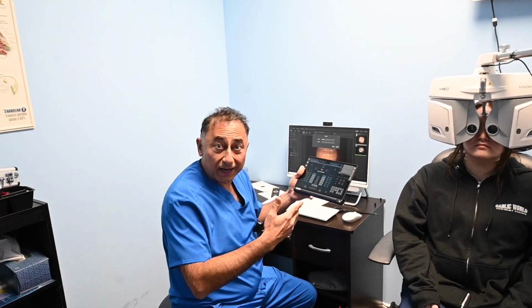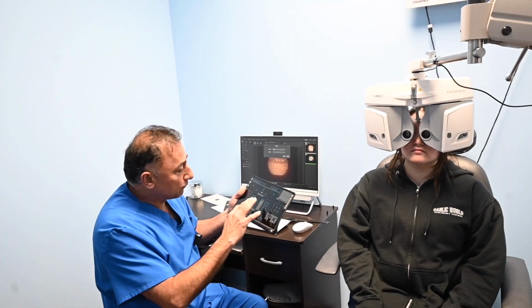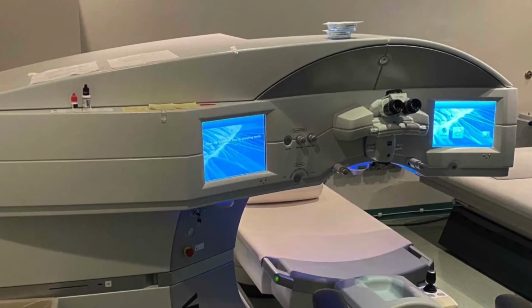Now that you've decided to have Smile eye surgery, and in the consultation you've been proven to be a very good candidate, we bring you to the preoperative exam, where not only the safety measurements which we had done, but we will be doing more advanced measurements and numbers check to make sure everything is stable, and that's where we calculate both what prescription to treat and what algorithm to apply to make modifications based on age, prescription, and our laser.